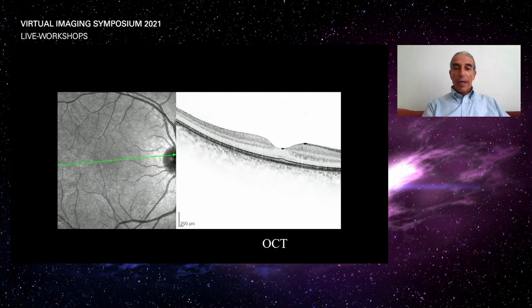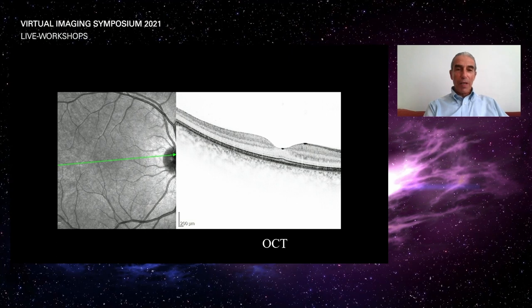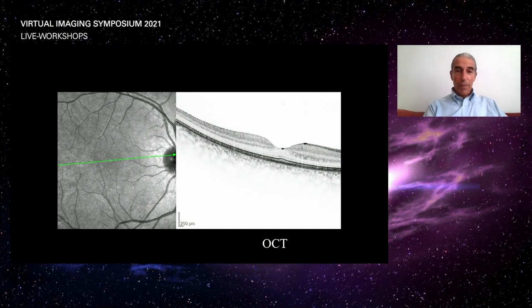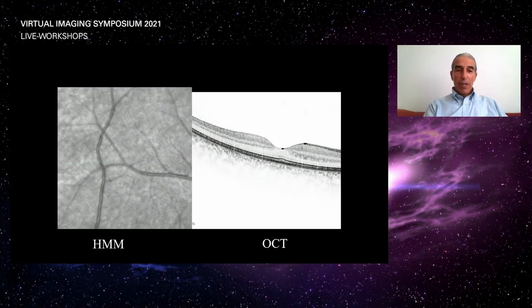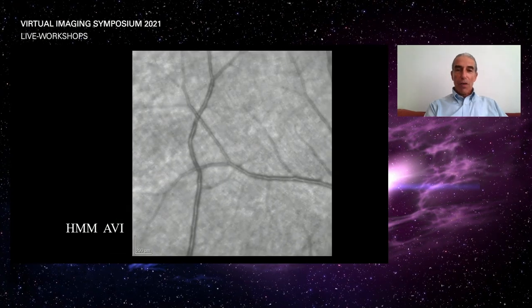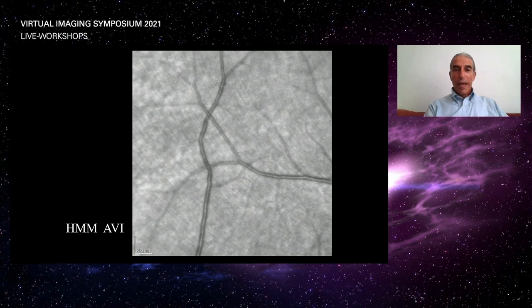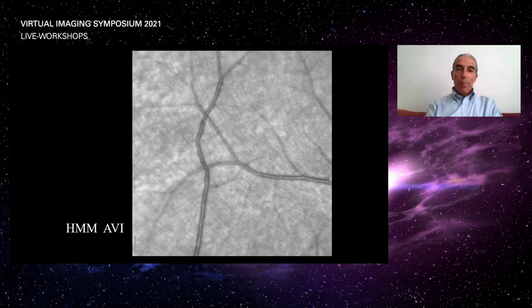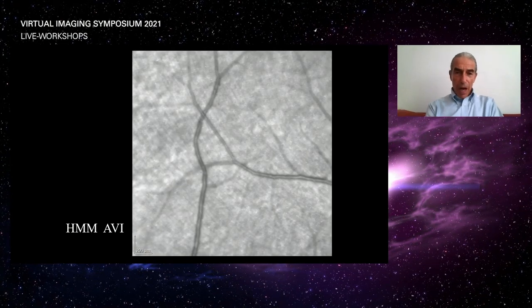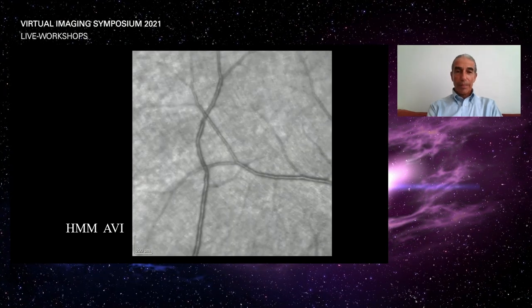Now, once more, looking at a simple OCT image with an innocuous infrared image on the left, which is our standard infrared image, we will discuss infrared at length a little later. We can magnify that image and look at the infrared image on the left and magnify it further and run a movie. Now, I know the lens was not intended for taking movies, but magnifying and running a movie, we can see the blood column flow in the infrared image, which was taken out of the OCT.